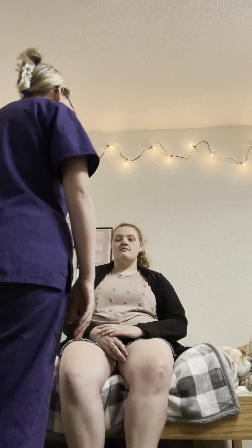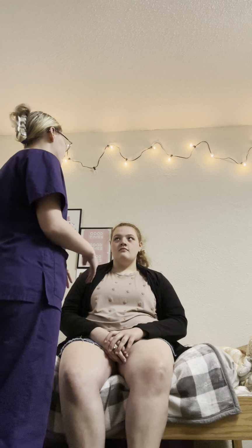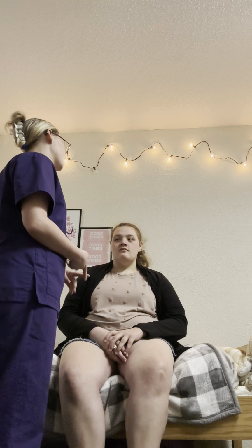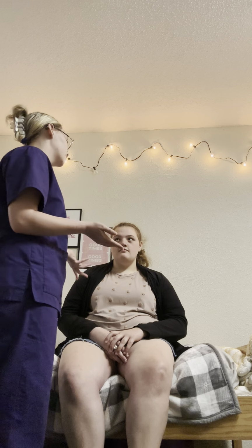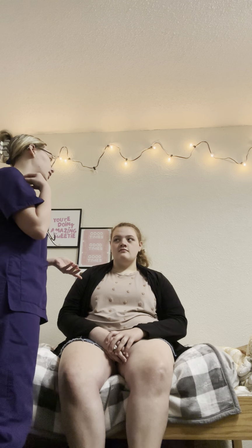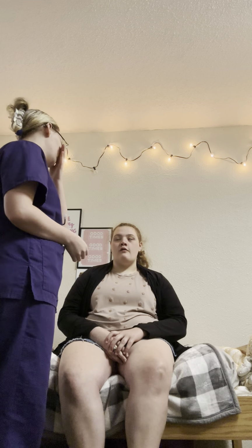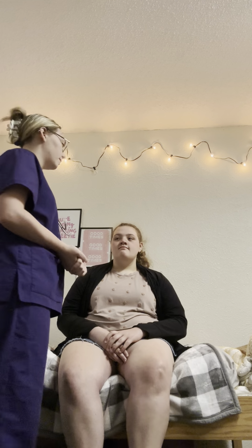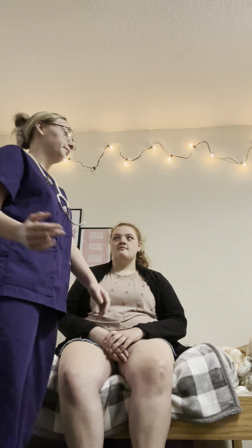Right when I walk in the room, I would tell her I'm going to wash my hands. And then I would take her vitals, which would be her respiratory rate, her blood pressure, her temperature, and do her pain scale, which I already asked her. Can you rate your pain on a scale of 0 to 10, if you have any? I would rate it a 0. All right, that's good. She doesn't have any pain. I would also check her pulses, but we'll be doing that later.